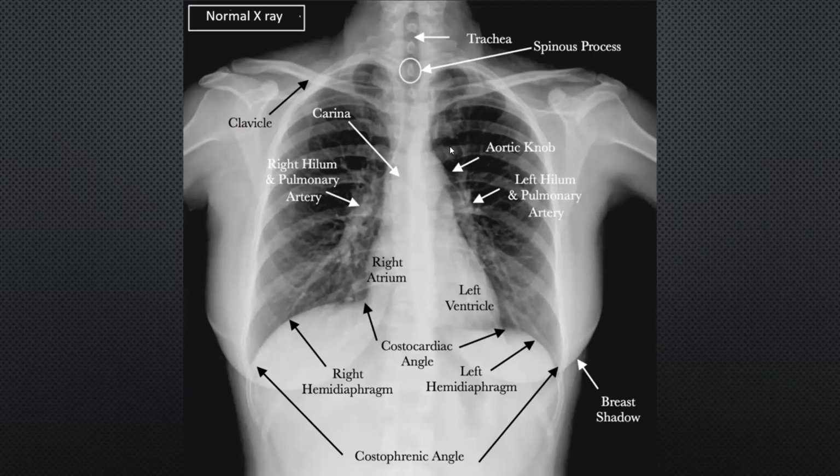In the exam, no need to be very dedicated. I mean, no need to put your fingers to the actor and confirm his understanding or not. Maybe he's not from the medical field, right? So just mention quickly, this is the trachea, but at least put your finger here.